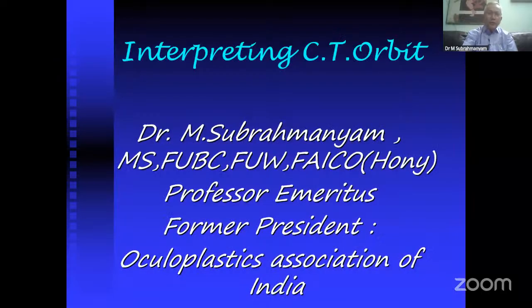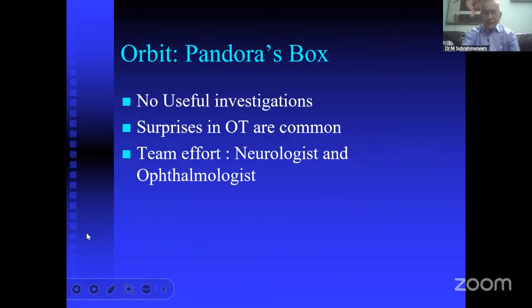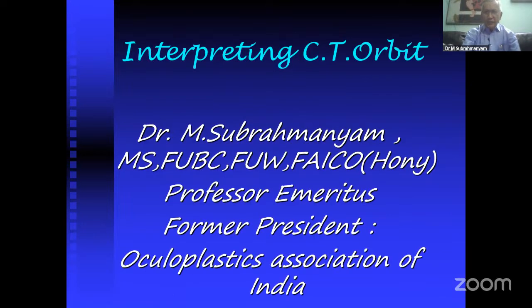Good evening and warm welcome to all of you. Today I'll be speaking about interpretation of CT orbit. That's the main focus.